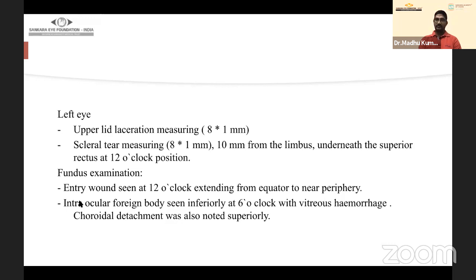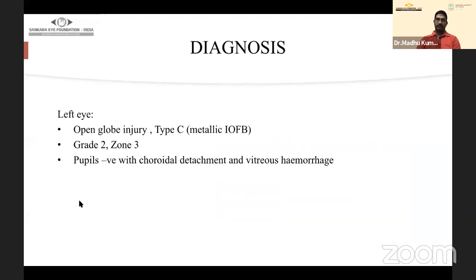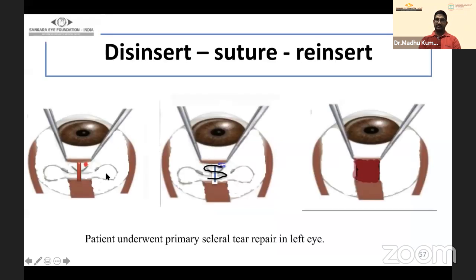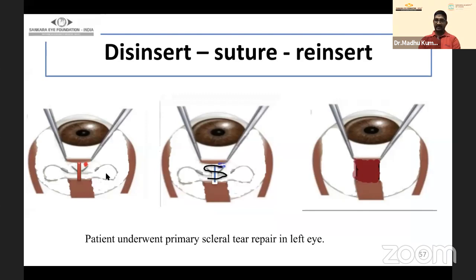Diagnosis: open globe injury type C (metallic foreign body), grade 2, zone 3, pupil negative, with choroidal detachment and vitreous hemorrhage. Because the tear was larger than in case 1, the plan was a two-step surgery. The patient underwent primary scleral tear repair. The superior rectus was isolated, sutures were taken, and the muscle was disinserted to expose the extent of the scleral tear.